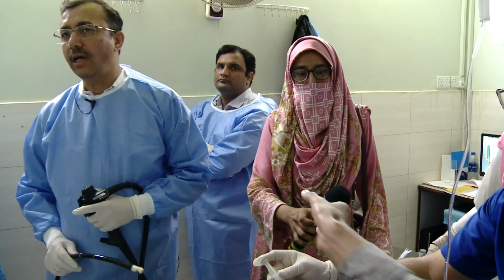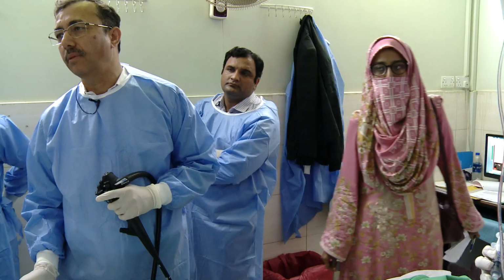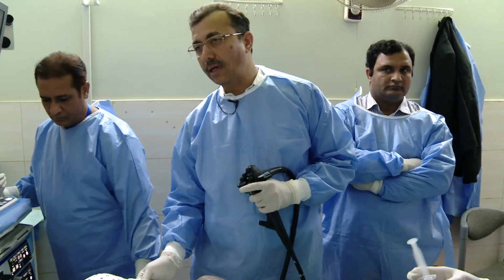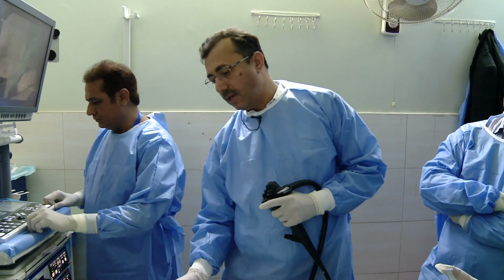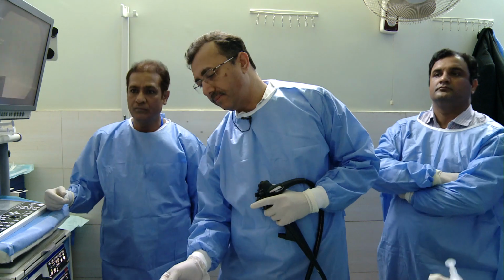Okay, so you've heard the history of this patient. Most likely this is a case of distal CBD stricture with cholangitis and hepatic abscesses. So I'm going to have a quick scan and then I'm going to hand it over to Dr. Shafkat, who is the trainee, and I'm going to talk him through this case.